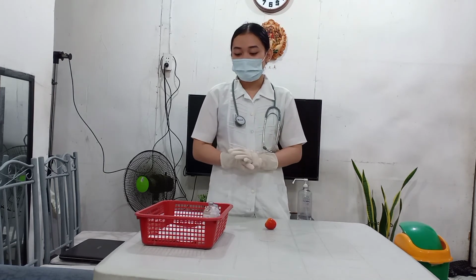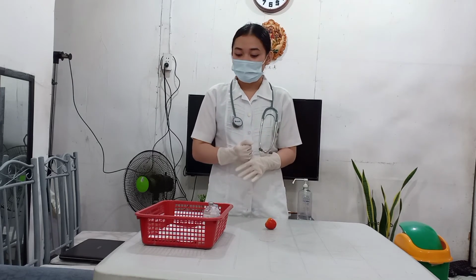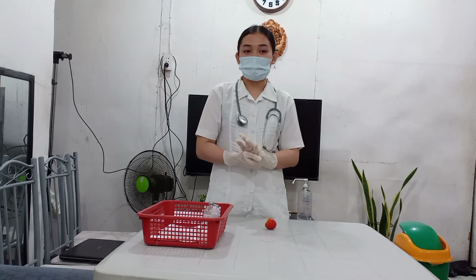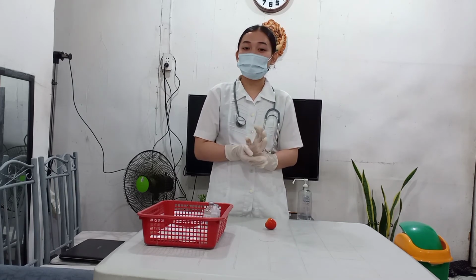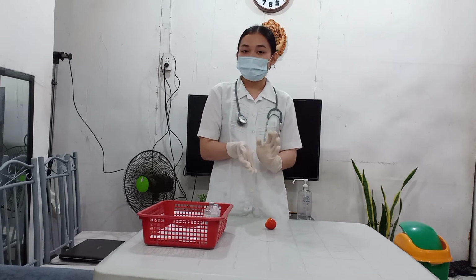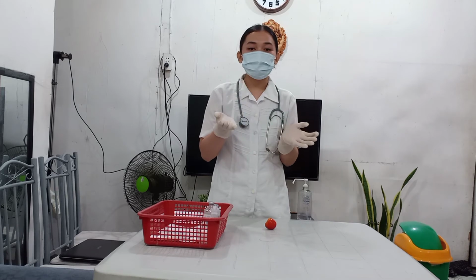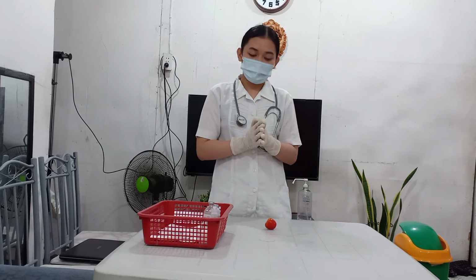So, since I've already prepared the medication during the previous procedure and already placed it here in my medication tray, I will now be proceeding to the third step, which is to introduce self and verify the client's identity, and also provide privacy, because introducing myself and verifying the client's identity fosters nurse and patient relationship while doing the procedure.